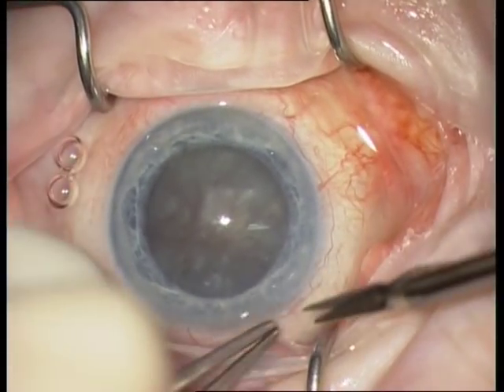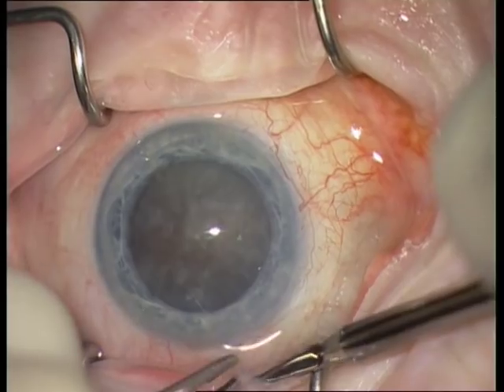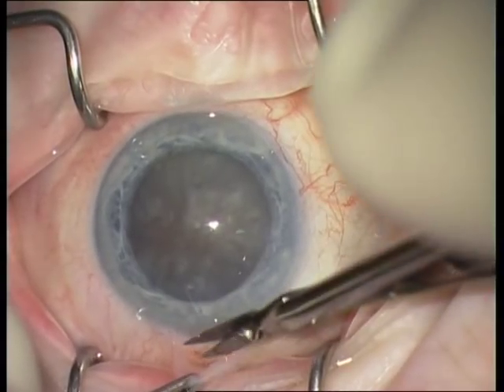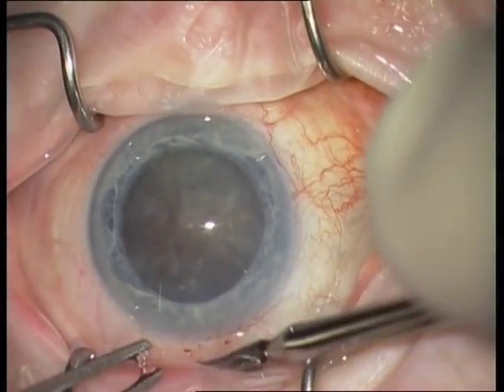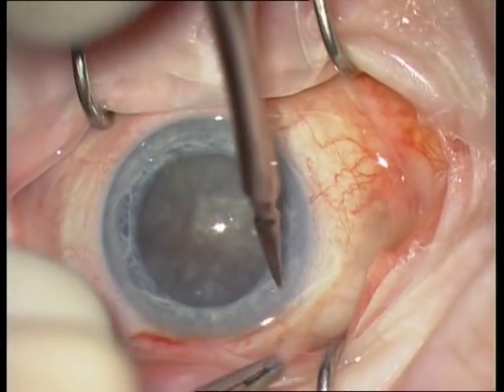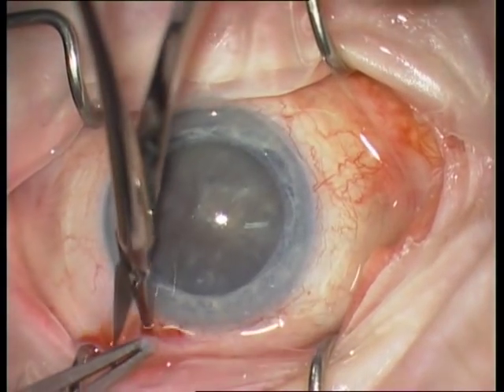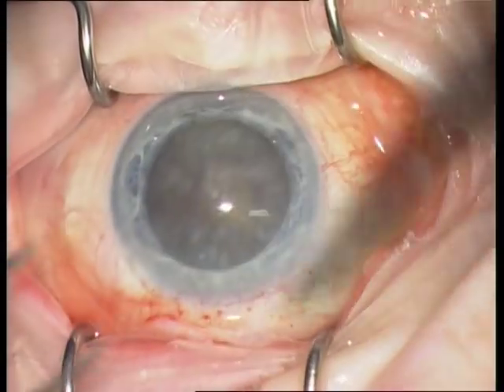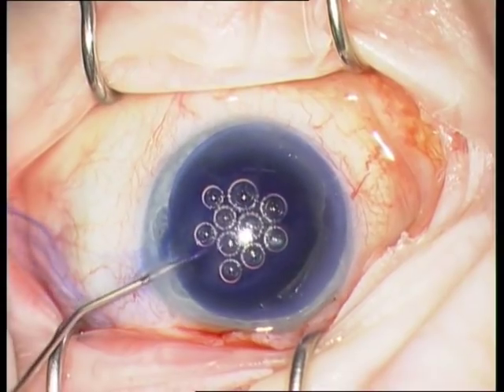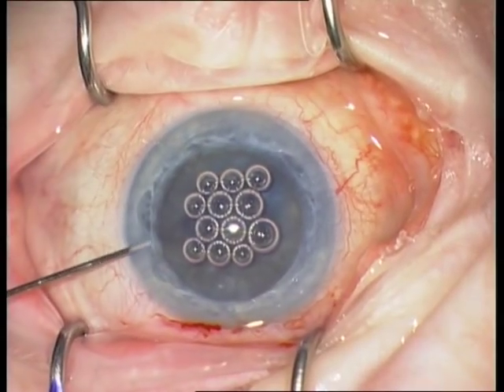I started with two paracenteses and continue now with a limbal peritomy at 12 o'clock. The main difference between a SICS technique and an ECCE technique is the main incision. In an ECCE technique, one performs a limbal incision, and in a SICS technique, one performs a wide scleral incision.